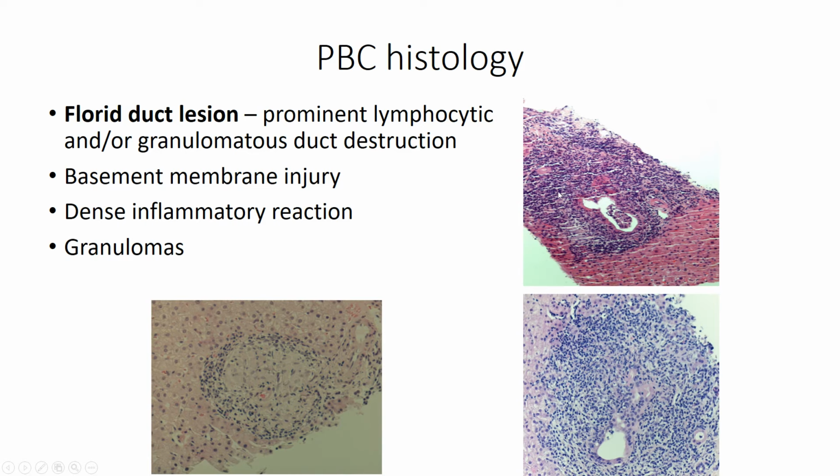And note that there's also this dense inflammatory infiltrate surrounding the portal tract, surrounding the bile duct, and also occupying the entire bile duct. You may see granulomas. Here's the artery. The granuloma is actually chewing up the bile duct. So remember the bile duct and artery going together. Here the bile duct is no longer apparent because there's this histiocytic granulomatous type of inflammation around the bile duct.